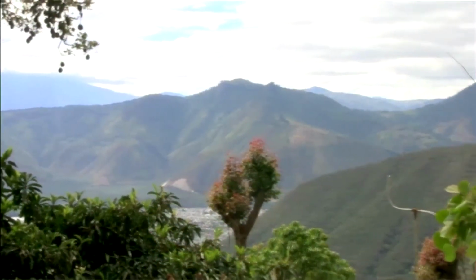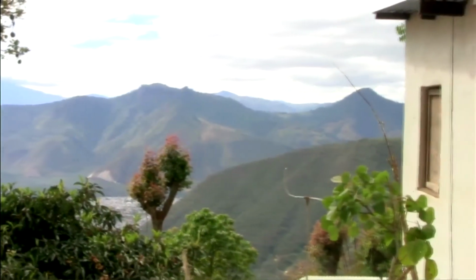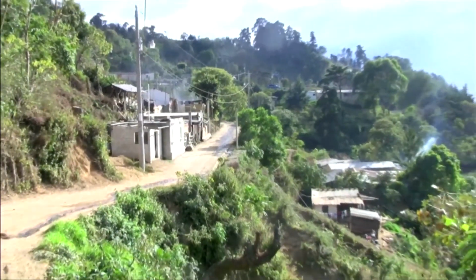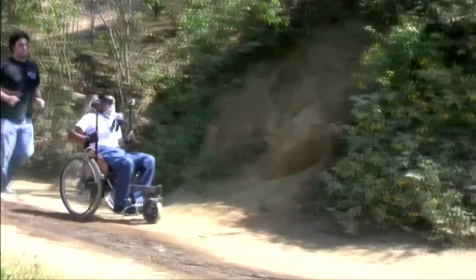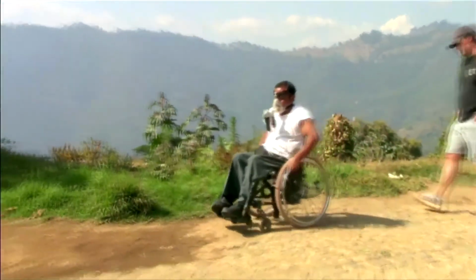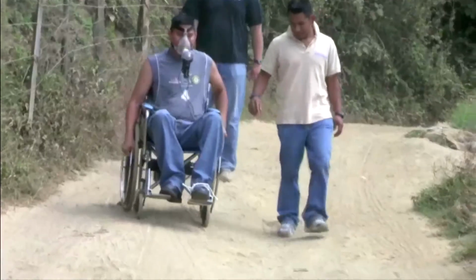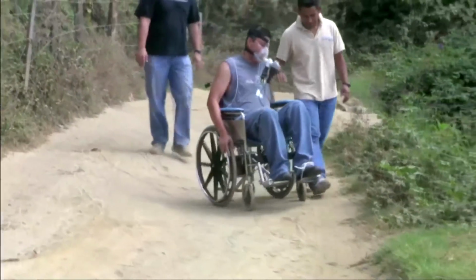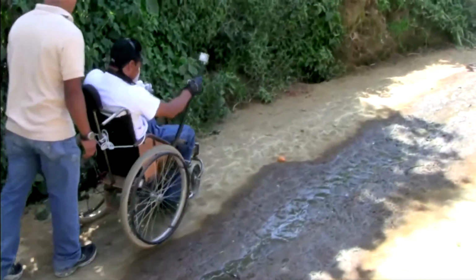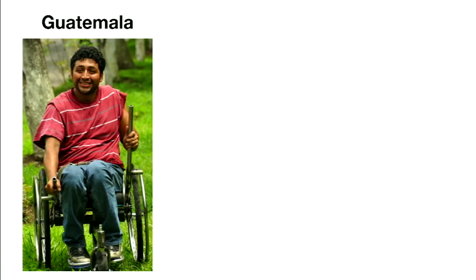So at this point, we embarked on our second field trial in Guatemala, and we did all our testing in a rural setting on a rural road where a person might want to travel. And so we tested people with this oxygen system and power system, both using their regular wheelchairs and the LFC in these normal operating conditions. And so at this point, we were using an upgraded version of the product where we implemented these design upgrades that we had figured out over the preceding year.